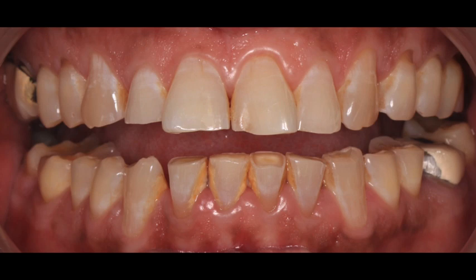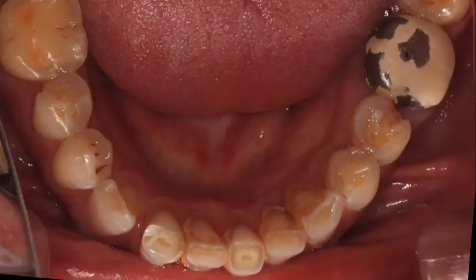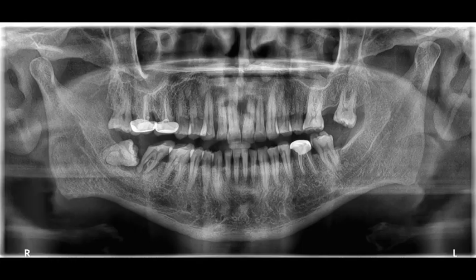Another case where the patient came with a similar problem, a collapsed bite and tooth wear, basically because of the loss of guidance and iatrogenic causes. If you look at it, he has a lot of wear at the back. This is due to a faulty crown on the lower, which was rubbing against the upper like sandpaper and eating away, and similarly vice versa, the upper crown was doing the same. So we first took an x-ray, an OPG. In an OPG also you can appreciate tooth wear along with other things.